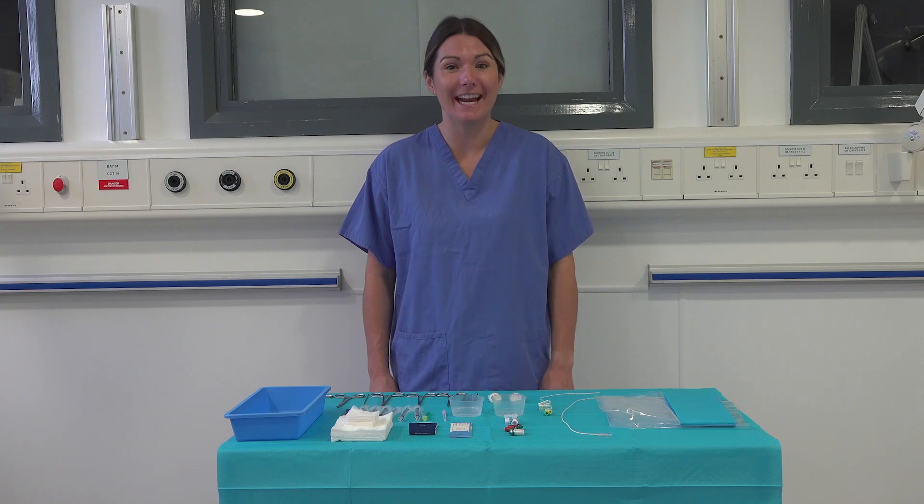Hi, my name is Sarah Berry and I am going to talk you through today the insertion of umbilical catheters.